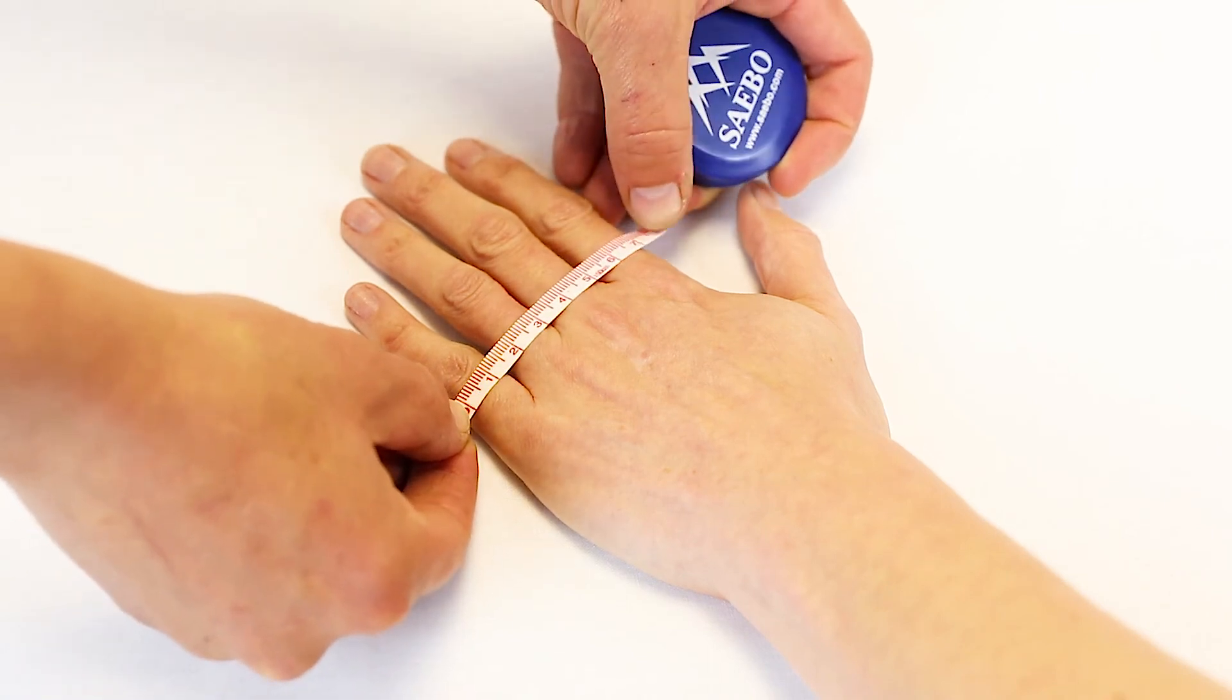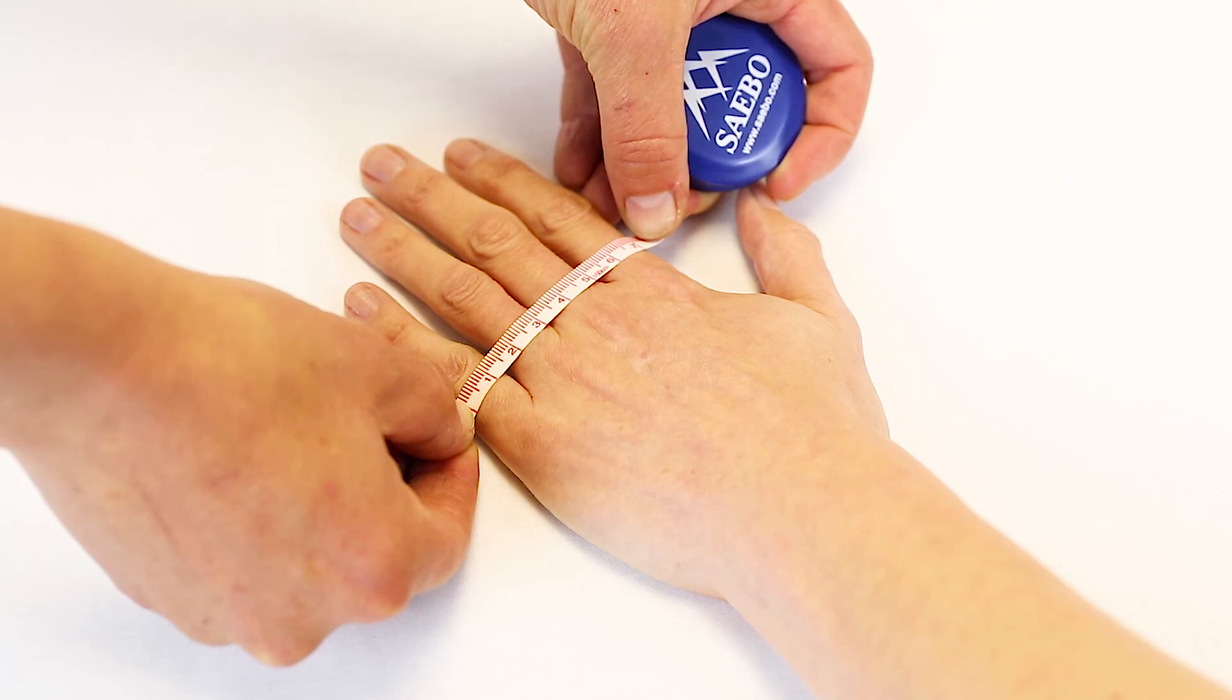Please do not round up or round down the measurement. This measurement determines if a small, medium, or large Sabo stretch is required and can be read in centimeters or inches.